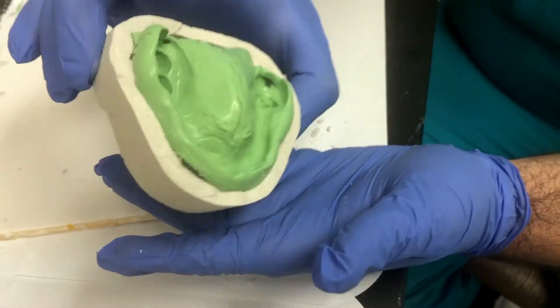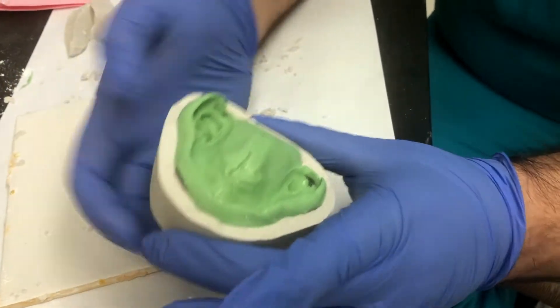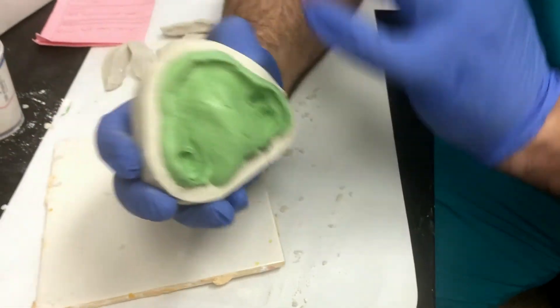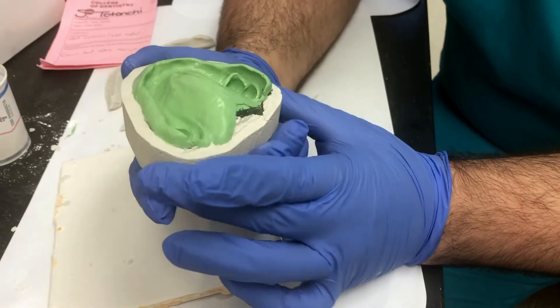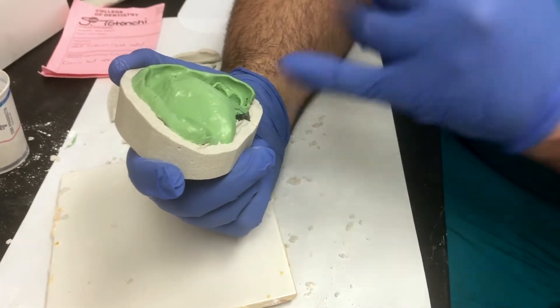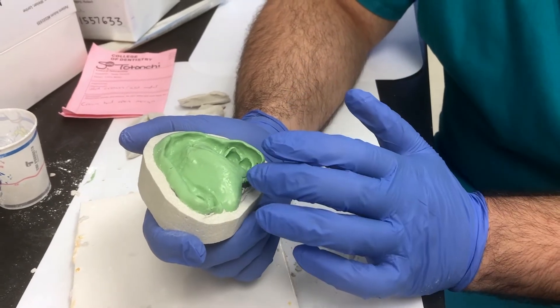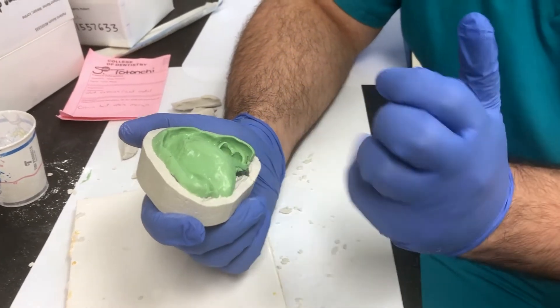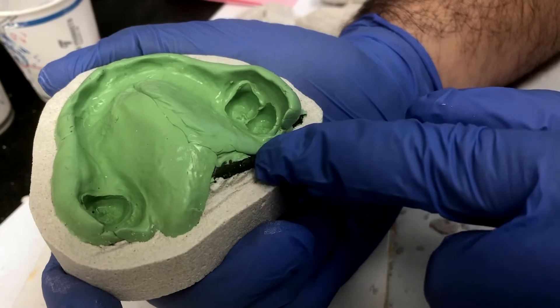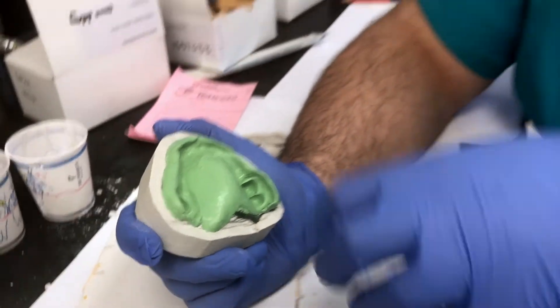After trimming, I have it as uniform as I want it to be. Since it's smaller, it'll be easier to box. I just tried to keep a nice uniform two to three millimeter land area all around. Before boxing it, if you have areas that are really thin, now is the opportunity to add some wax and thicken it up. Because if it's too thin when you pour it up, it's going to be really hard to make a record base or wax rim to go into that really thin area. So we're going to add some wax to make it about one to two millimeters thicker.